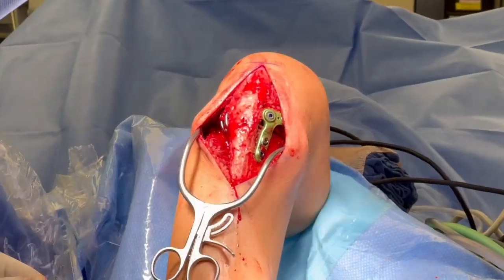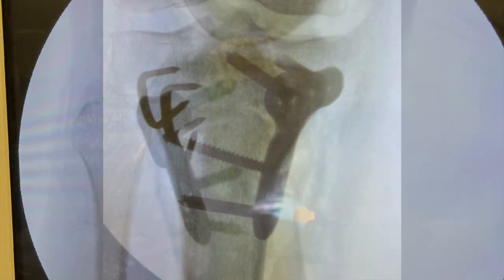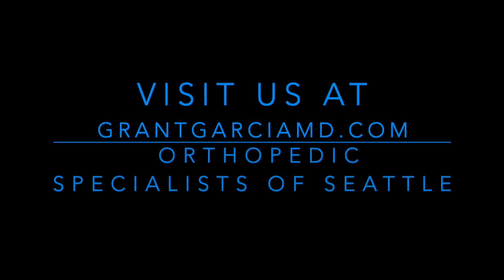You can see we're easily ranging the knee — there is no gapping whatsoever. I feel really good with letting them start range of motion in about a week or so. You can see good closure. We've completely reduced the slope. It already feels better in terms of Lachman, and the patient will go on to continue weight bearing and have a revision surgery in about six months. Thank you.